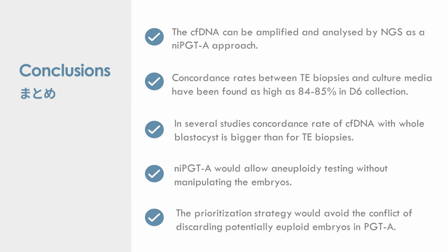That this non-invasive approach will allow us to analyze for aneuploidy without manipulating the embryos, and this prioritization strategy will avoid the conflict of discarding potentially euploid embryos. It's just a classification of the embryos.